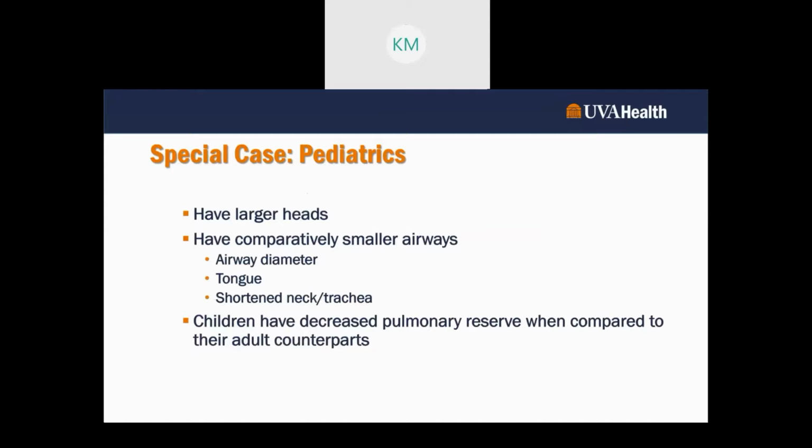Other things we need to think about: what does it mean when we have comparatively smaller airways? The airway diameter itself is smaller, which you can expect, right? You look at a little kid versus an adult just in terms of the size.